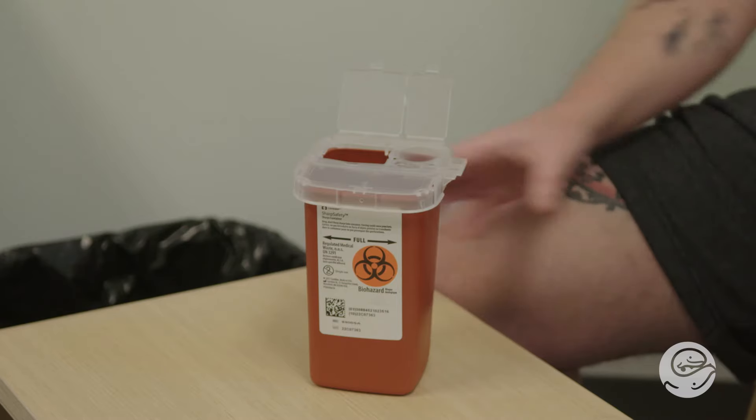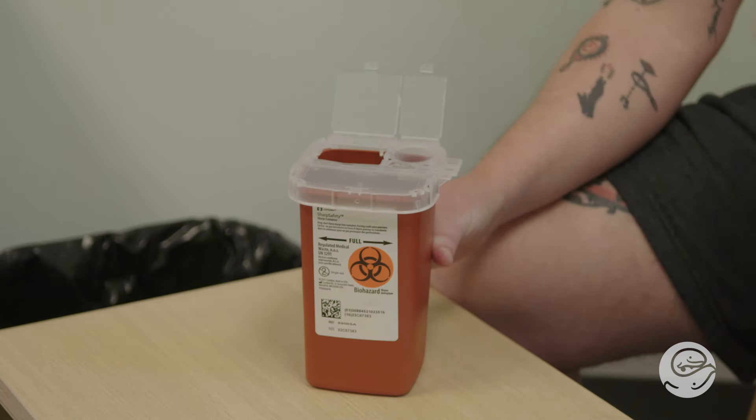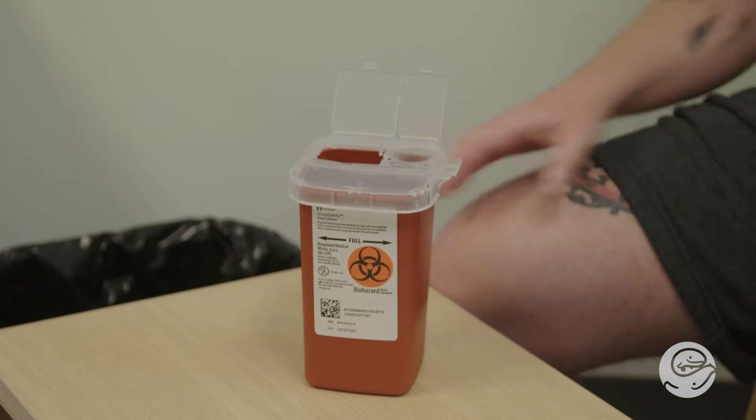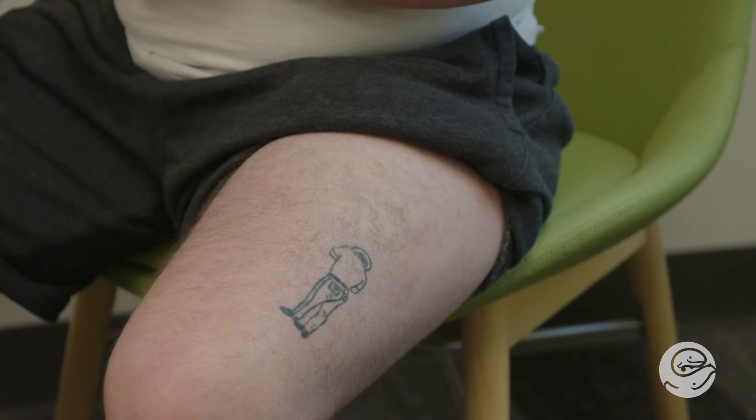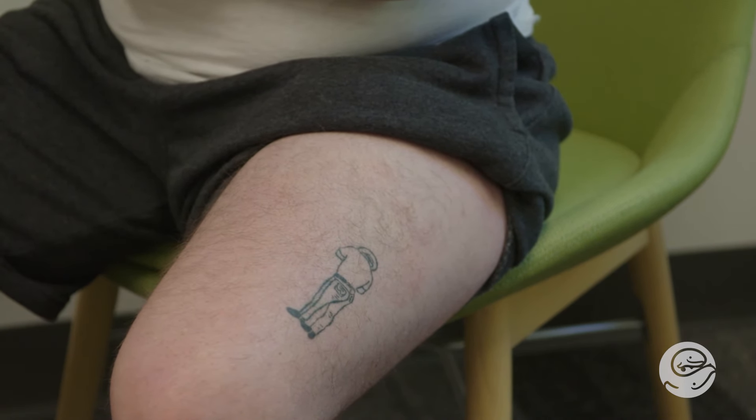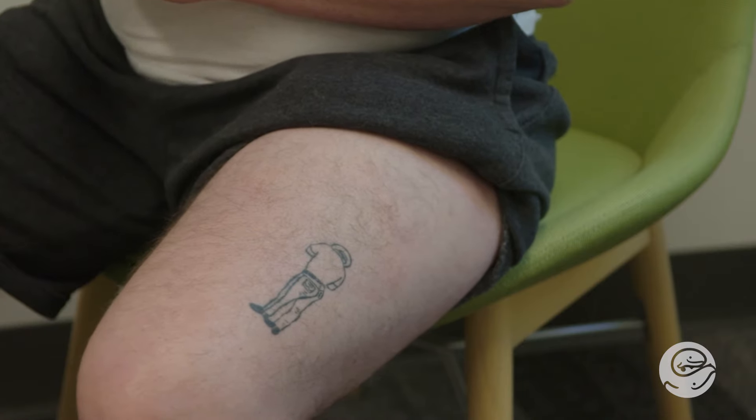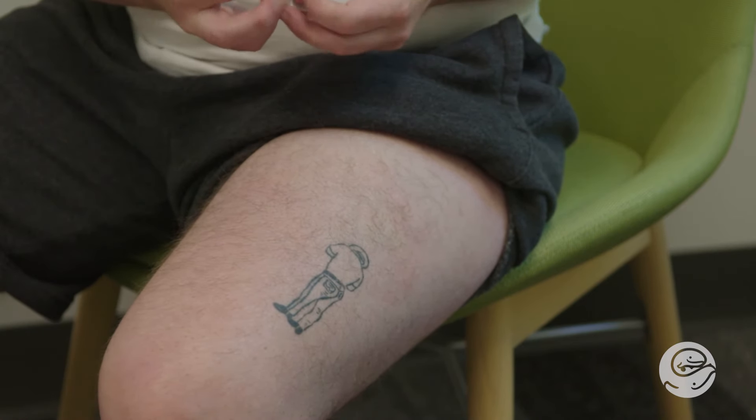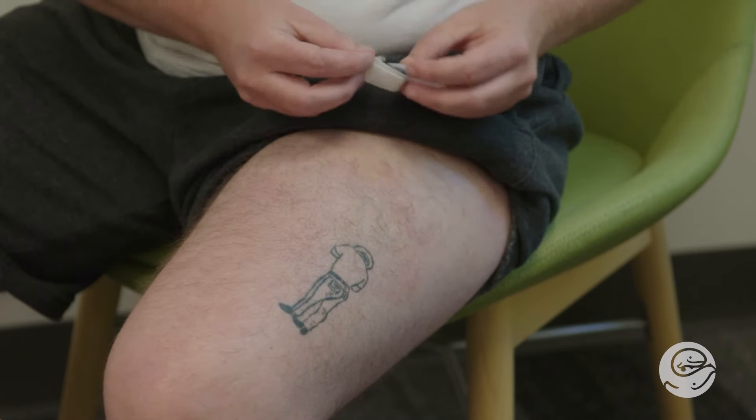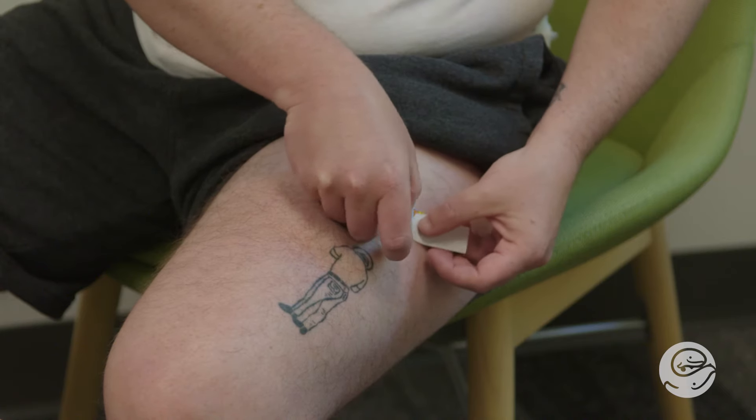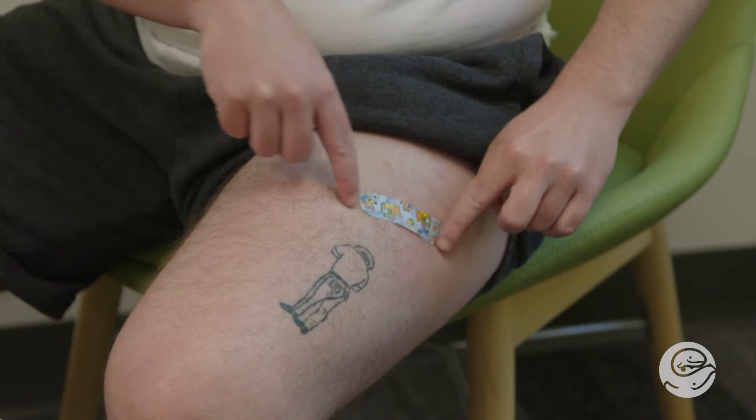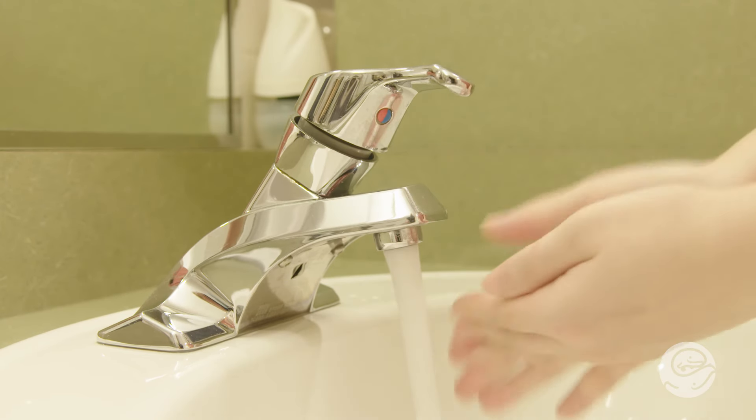Do not recap the needle. Put the needle and syringe directly into a sharps or puncture proof container. If needed, put a band-aid over the injection site. It is normal to have a small amount of blood or medicine that comes out of the injection site right after the injection. When you are done, put away your supplies and wash your hands.